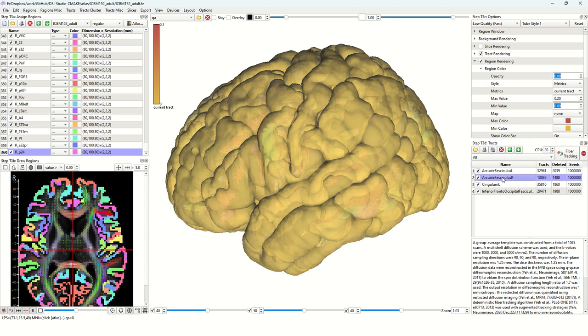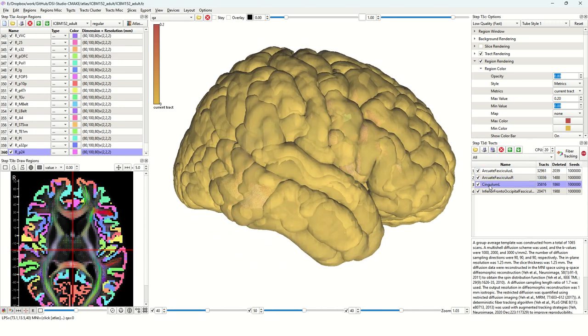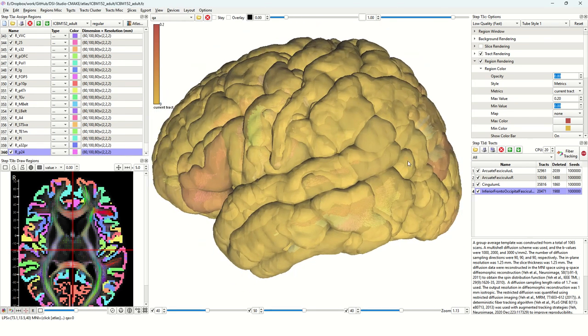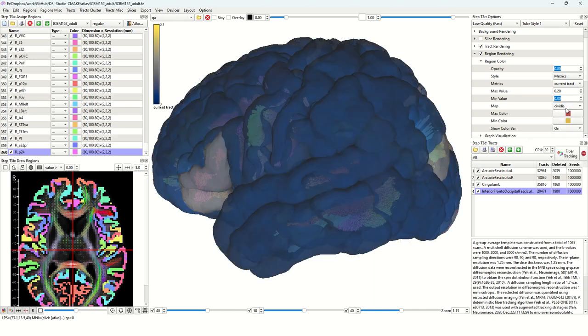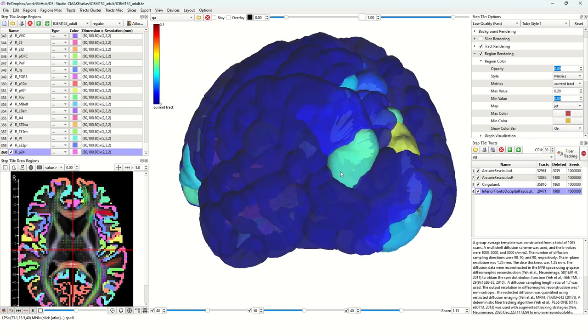If you select the second one, the right-hand side, you'll see the right-hand side showing up. Cingulum or inferior frontal-occipital fasciculus, you can visualize the track here. Instead of showing different colors, you can have a color map. There are some built-in color maps ready to use for visualizing the connectivity based on your preference.